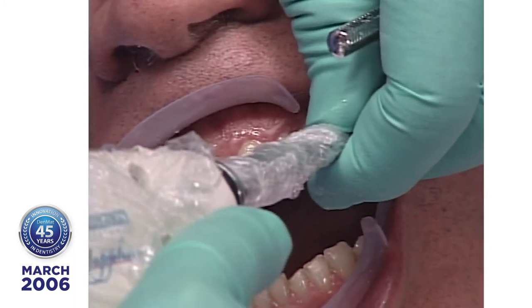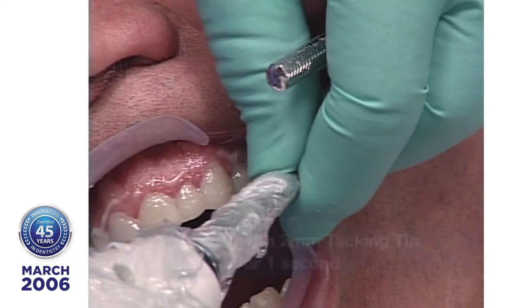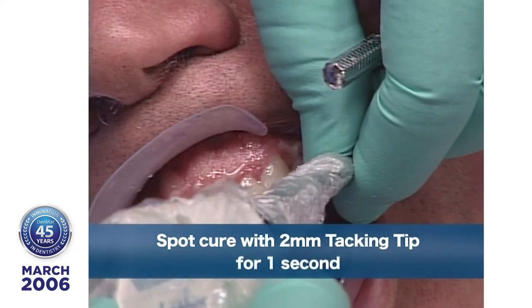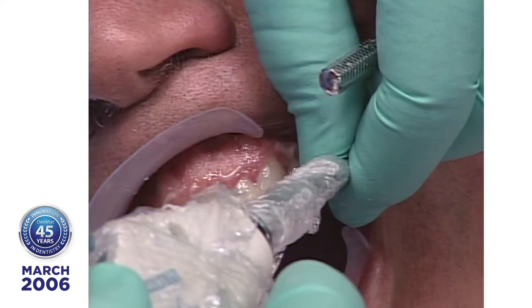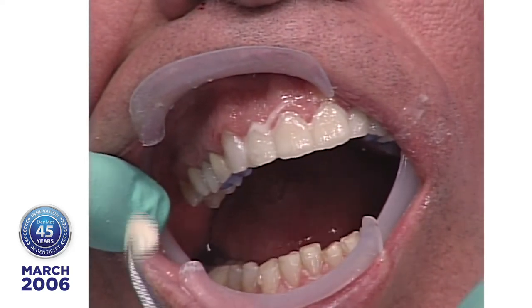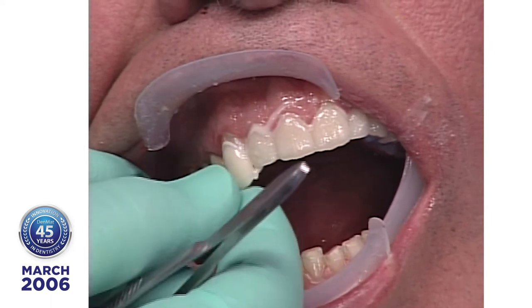What I'm doing now is spot curing with the 2 millimeter tip for 1 second in the middle of the tooth. And then you want to make sure you have these placed just right, with your eyes. Okay, now what I've done is I've spot cured these in place. And I'm going to come over to the right side now.